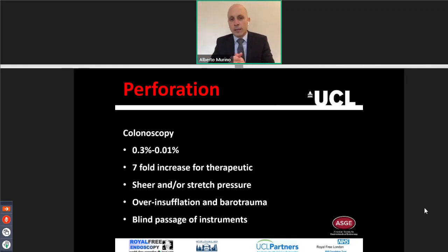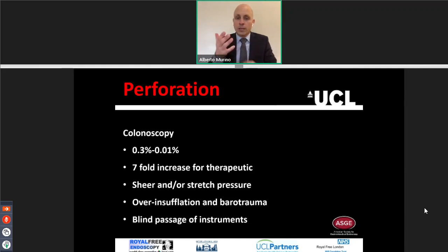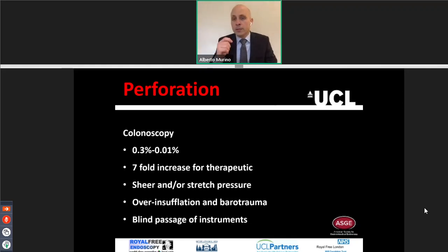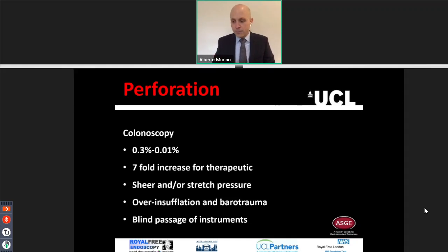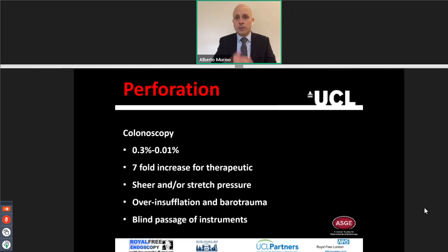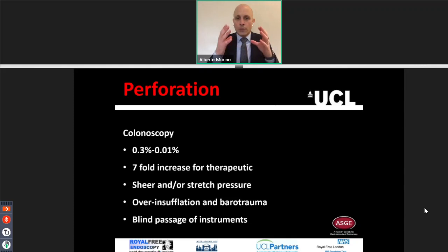Over-insufflation and barotrauma can cause perforation. If you see that the colonic wall is starting to bleed and there are some scratches, it means there is too much gas inside the bowel. We are now using CO2, so this is a very rare event. Before with oxygen it happened more often. But still, if you see this happening and the patient is in pain, you want to suck the CO2 and reduce the tension.